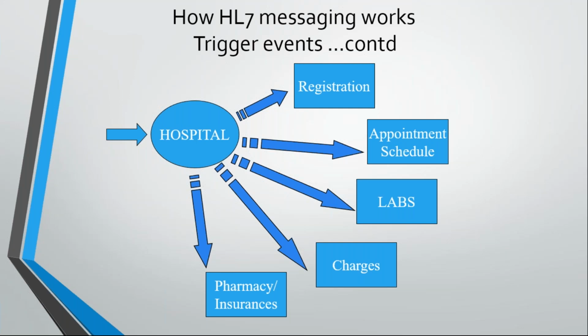Okay. And what is CCDA? Where exactly the CCDA is used? CCDAs are used when we integrate with HIEs. So we'll be shedding more light on that in the last session of our training. Okay. So they are also documents. To brief, they are also documents, but they are not used for regular data transmission between the hospital systems. They are used to share data with a central repository. Okay, that works. Thank you. Yep, sure.